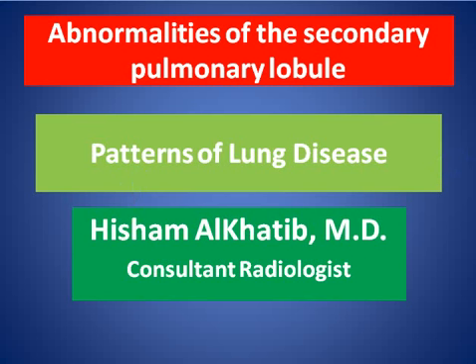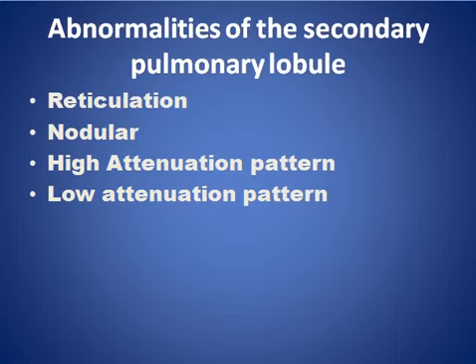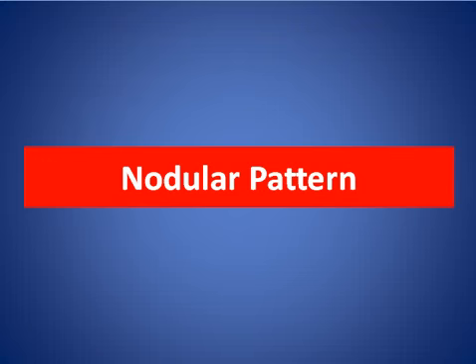My topic today is a continuation of what I discussed previously about the abnormalities of the secondary pulmonary lobule. I discussed previously the reticular pattern involving the secondary pulmonary lobule. Today I will discuss the nodular pattern involving the secondary pulmonary lobule.